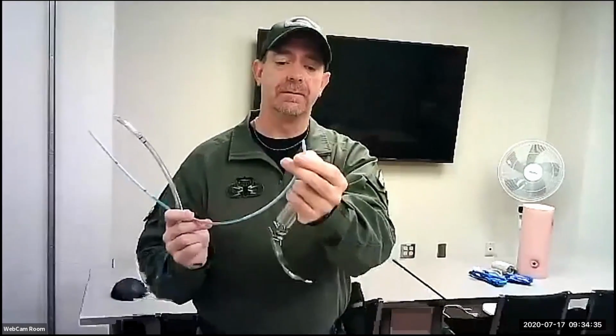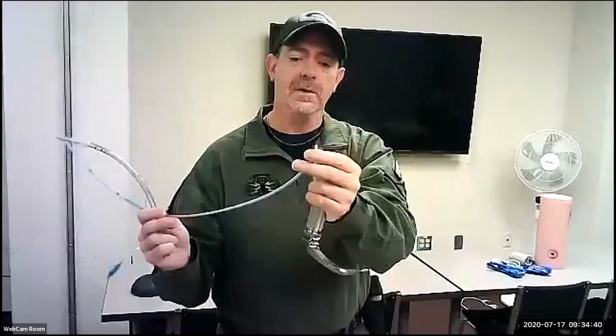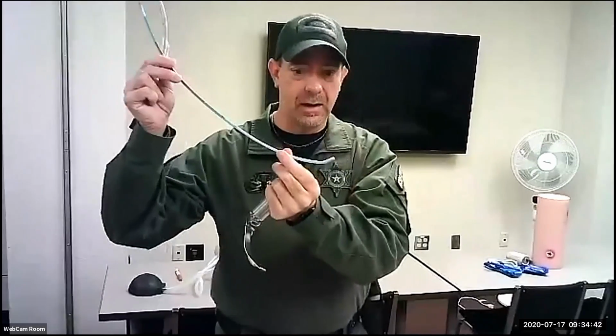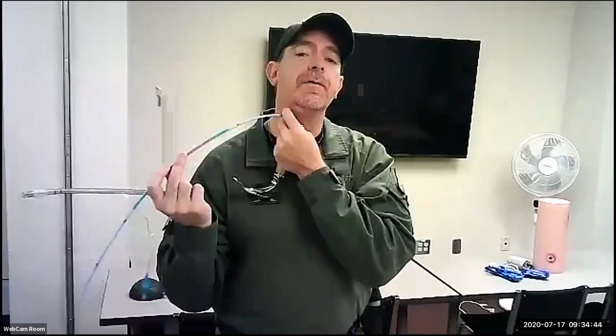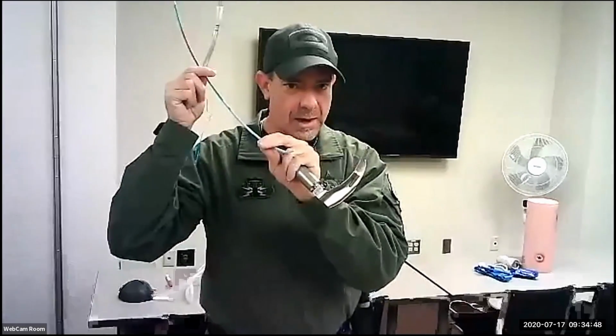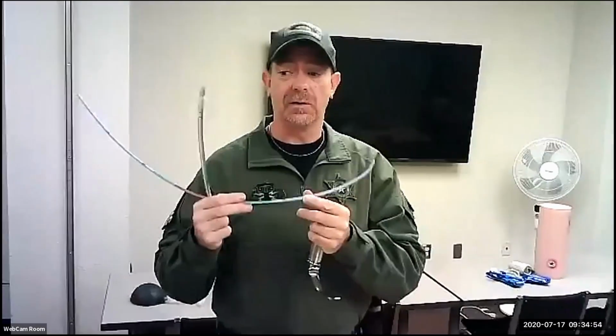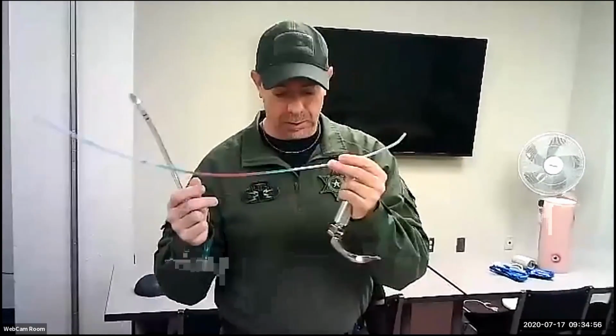All right, the reason why it's curved at the end is that you can feel the tracheal rings. As you're going into the trachea, I'm feeling this bump off the tracheal rings. So it's sliding down, it's like little speed bumps. I can go back and forth and kind of know, yeah, that's trachea. The esophagus is smooth. So if I'm in the esophagus, I won't feel those tracheal rings.